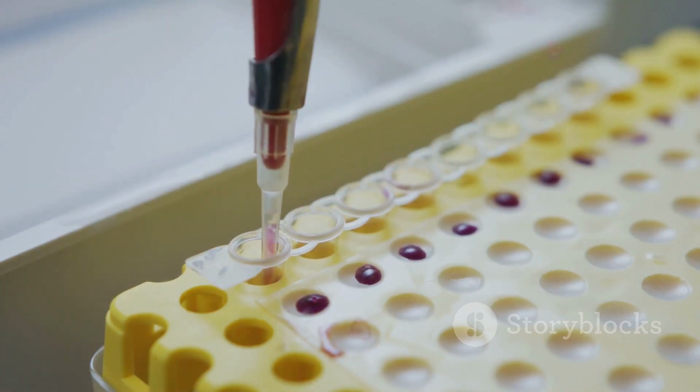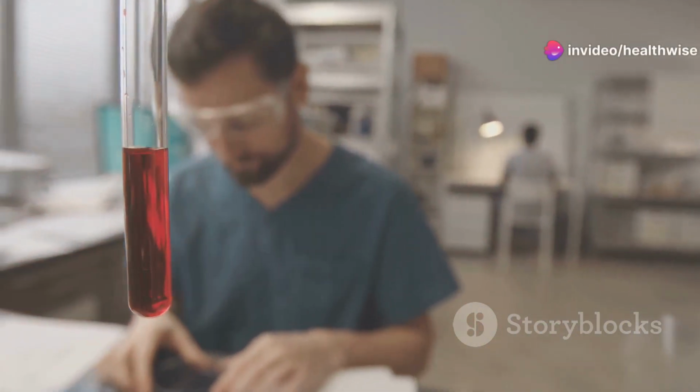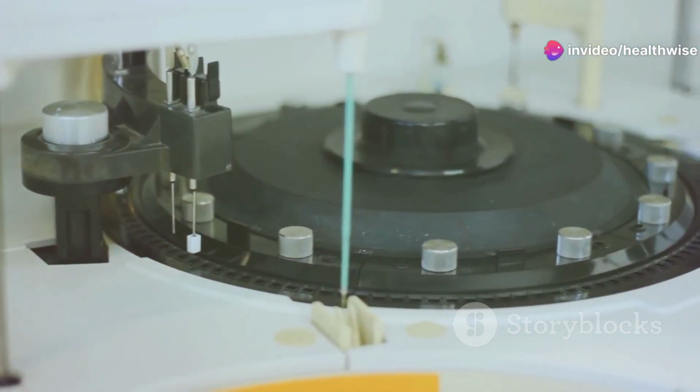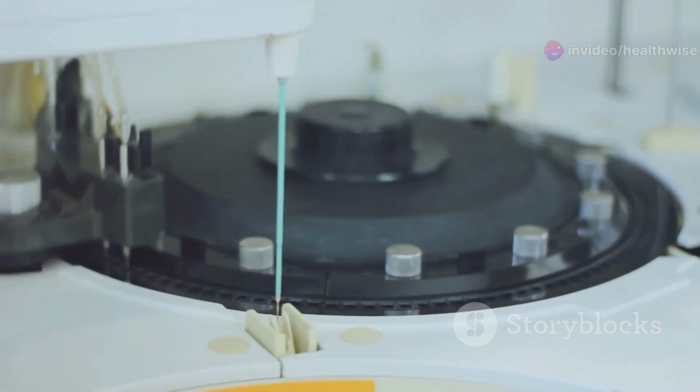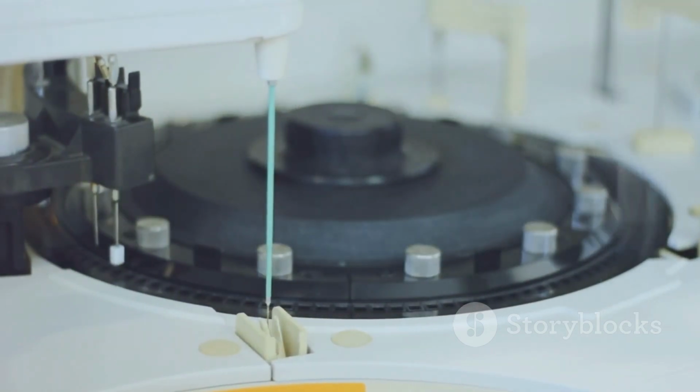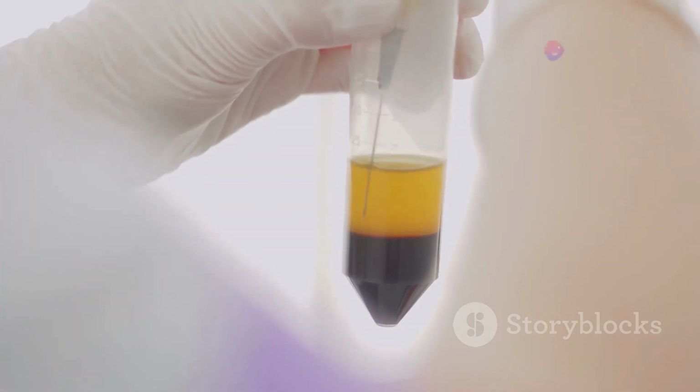First up, Esbach's test. This test is all about protein precipitation using picric acid. You'll need Esbach's reagent, which is basically a 1% picric acid solution, and an Esbach's albuminometer, a special graduated tube that comes in a wooden cover. Here's how you do it.